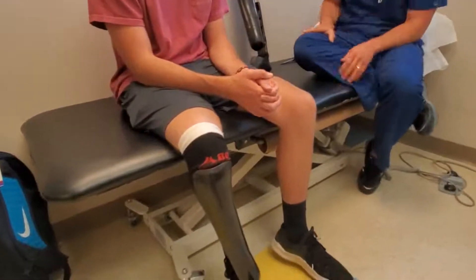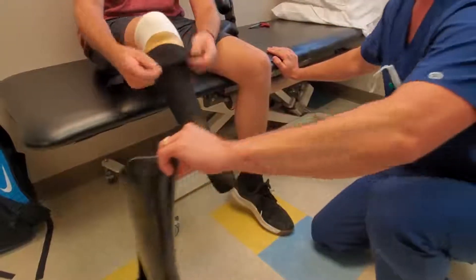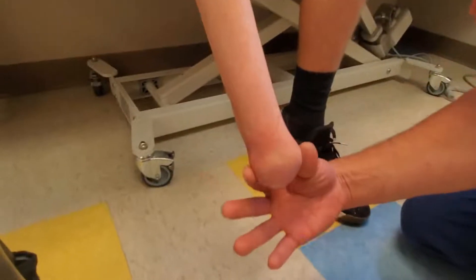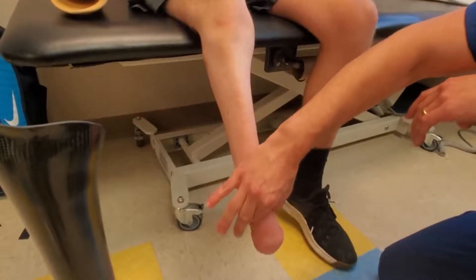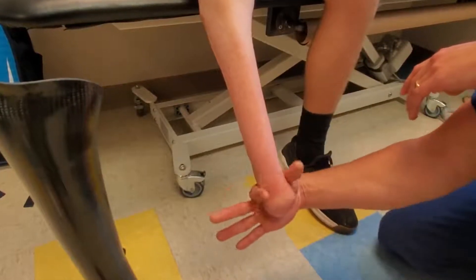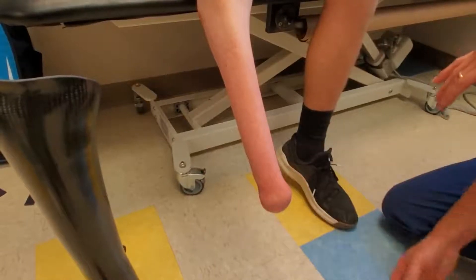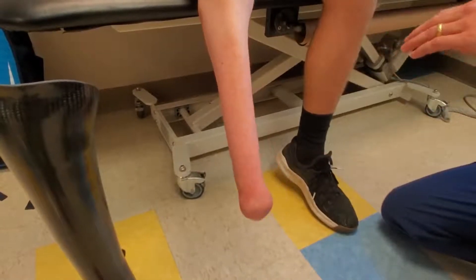I'm going to have Alex slip his prosthesis off so we can look at his residual limb. He's not very bulbous distally, but he is bulbous enough to capture an anatomical suspension. Over time he's gotten more bulbous anatomically, not so much volumetrically. I can feel his tibia and it bows out where his medial and lateral malleoli once were. There's enough anatomy here to suspend, and we are suspending distally — he is supporting all his body weight on the distal end of his heel pad.